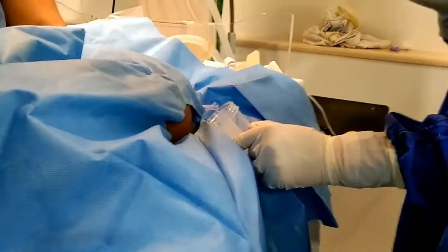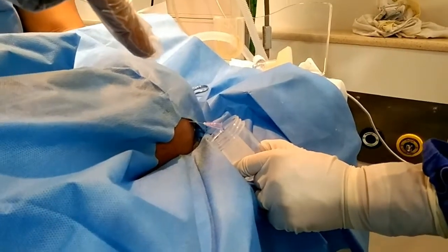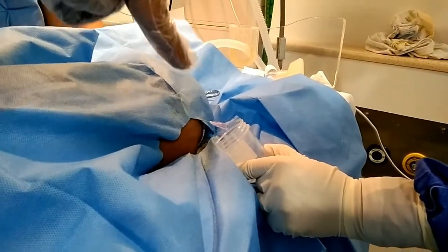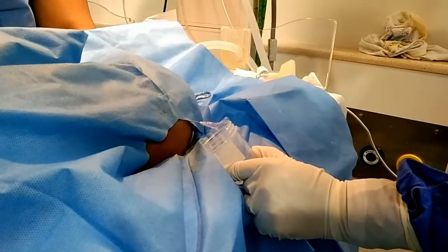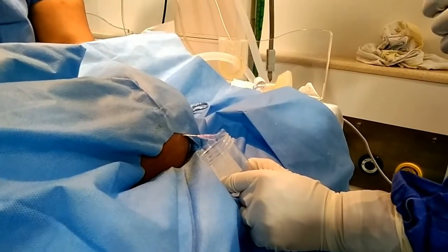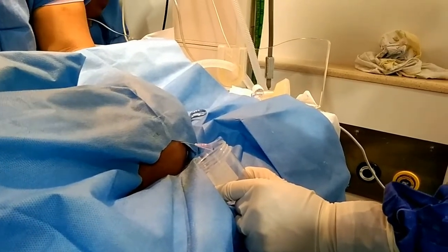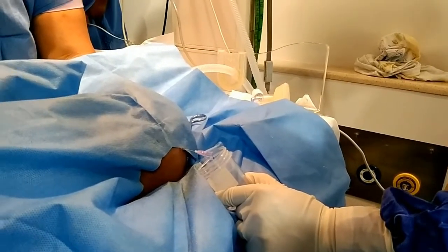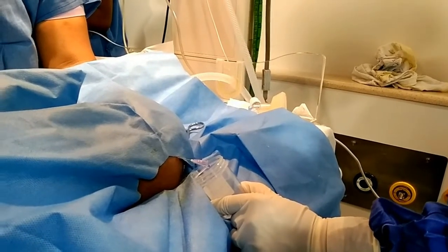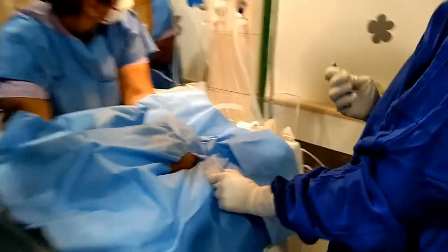Now you see that she has gone around 0.5 cm depth into the space and is getting the fluid. You can see the fluid. So ultrasound helps in determining the length that should be traversed to tap the cerebrospinal fluid. Especially it is very important for beginners who are learning lumbar puncture, to perform it without any trauma. Thank you.